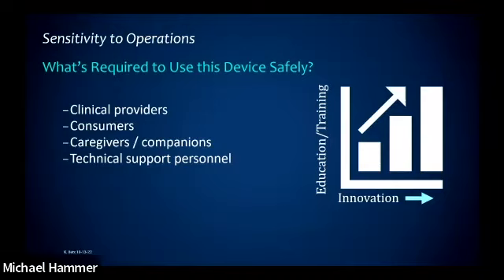I see some of my colleagues in the room. So I need multiple staff for 3.5 days to be trained in this device, and it's a cognitive load, and then we have to teach someone how to use it, and it's a cognitive load for them, and then you have to maintain competency by doing it all the time, but we're not issuing exoskeletons all the time. So when a year goes by, I forgot how to do all of that.